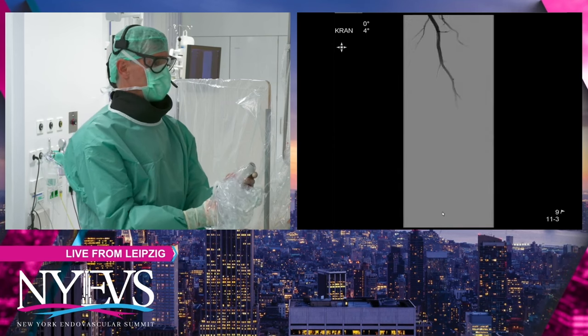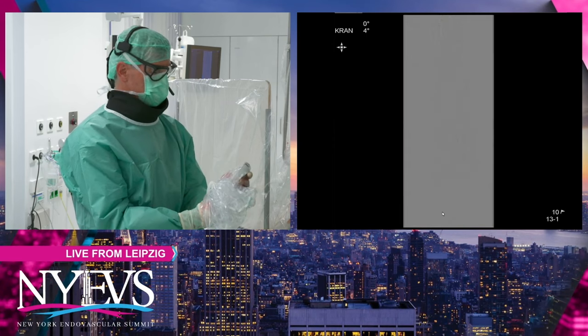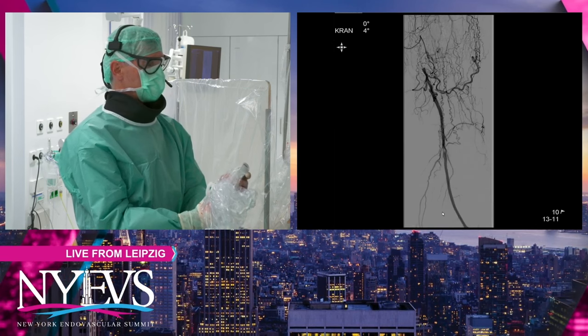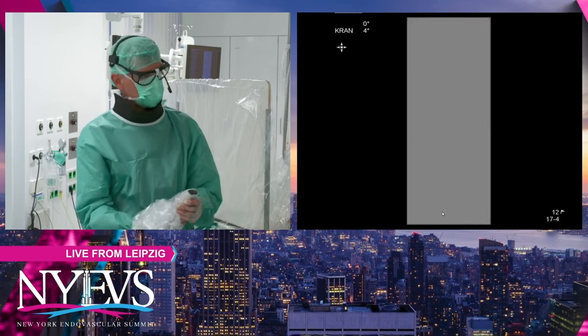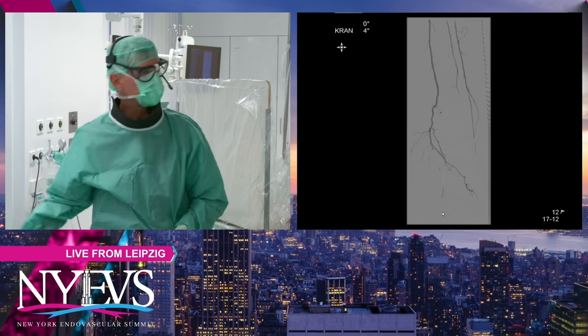Once again, I filmed the outflow. The total occlusion, the popliteal has another high-grade stenosis. Outflow is okay. I think for us, why not endo? Sure.